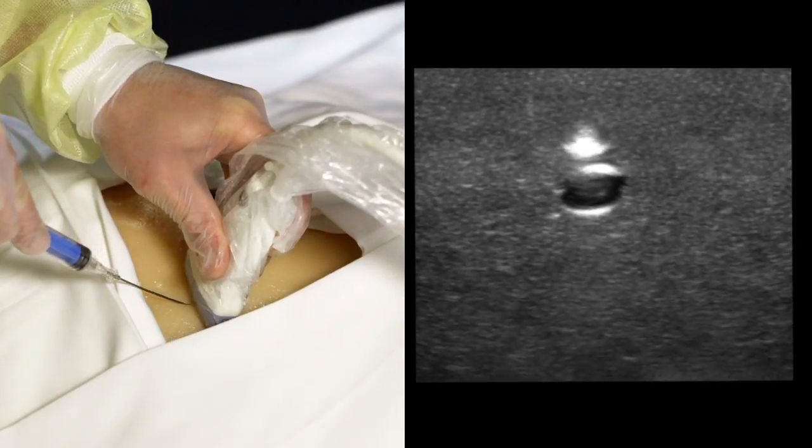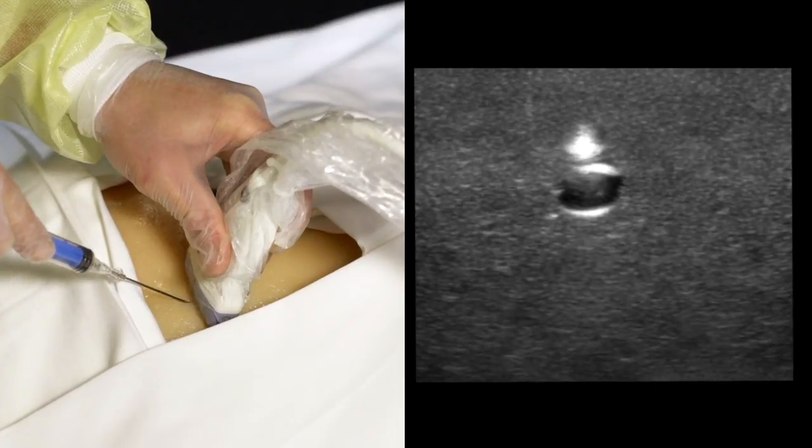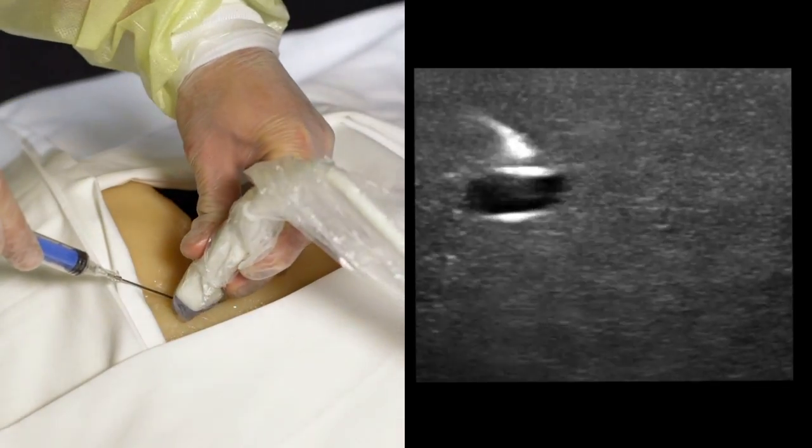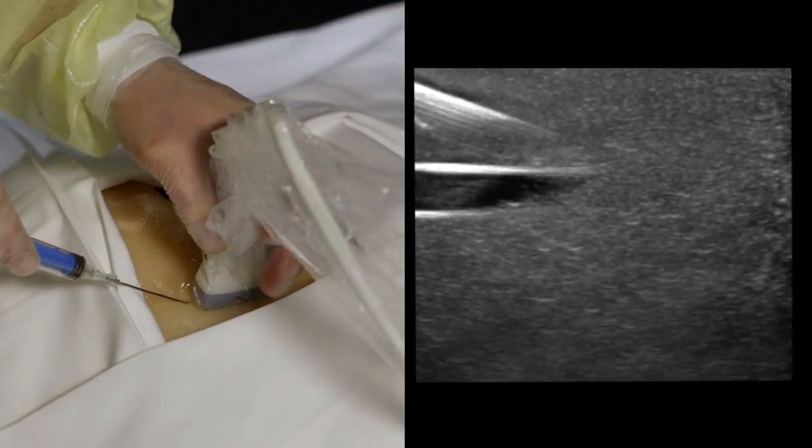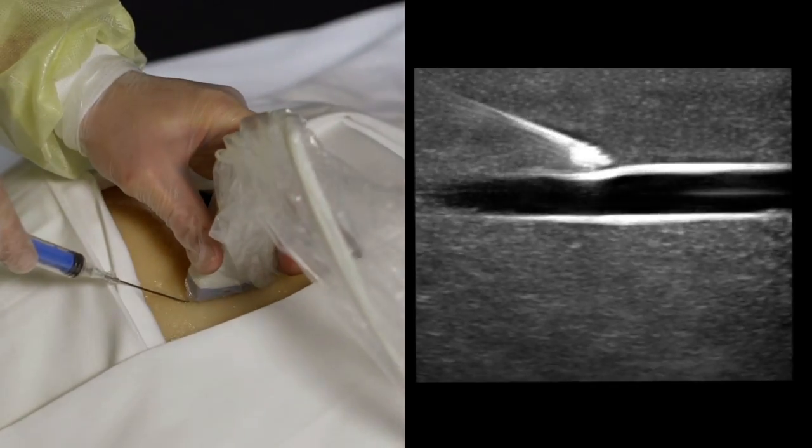Once you have some experience with the transverse view, consider adding in a longitudinal view at this point. When you're satisfied that the needle is directly above the vein, rotate the probe from transverse into the longitudinal view.